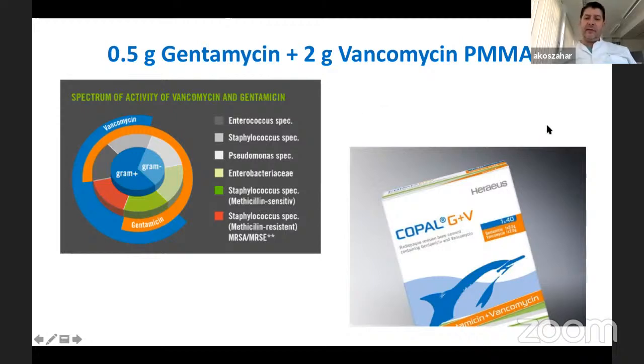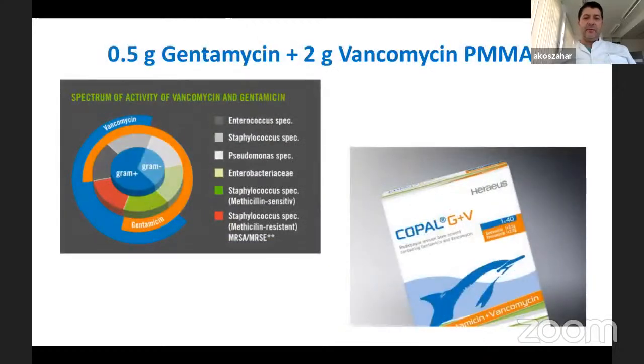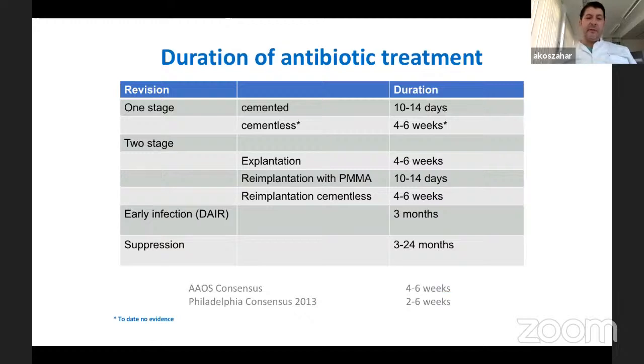You can even add antibiotics to these manufactured antibiotic loaded bone cements based on the susceptibility, based on your recommendation from the microbiologist. When I have this kind of cement, gentamicin, clindamycin, PMMA, then I add 2 grams of vancomycin. Or when I have this one, I can add 2 grams of meropenem based on the susceptibility.